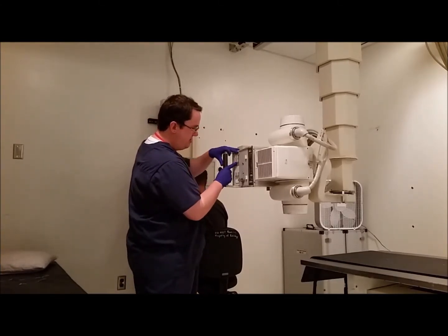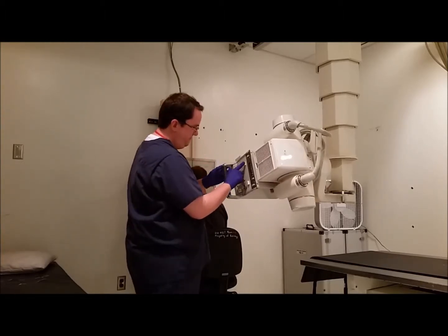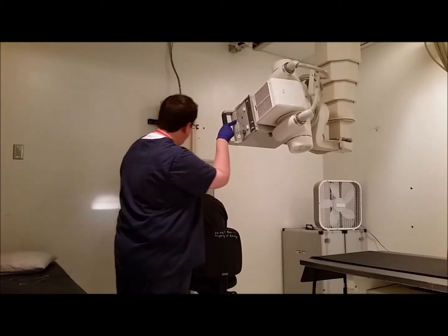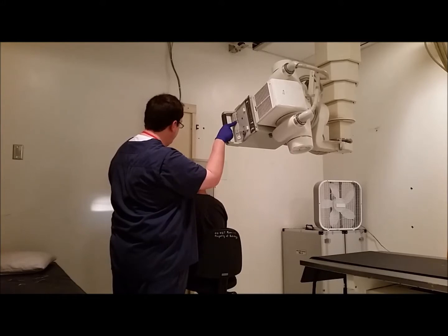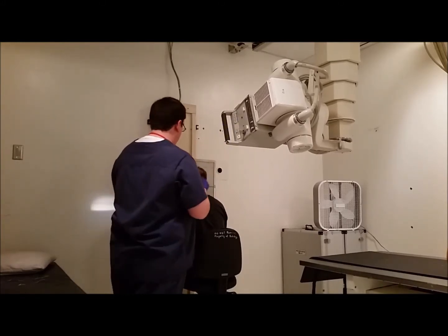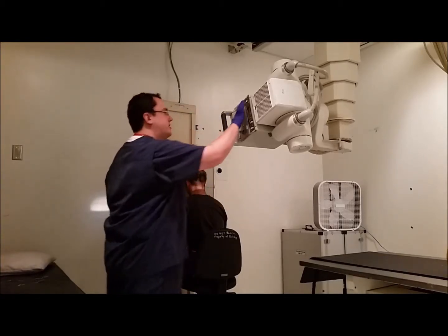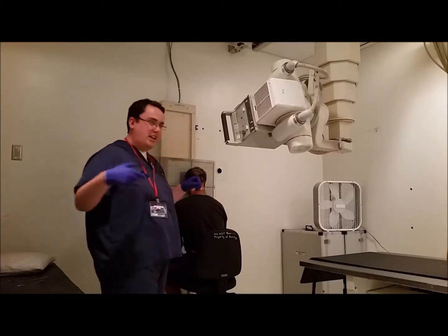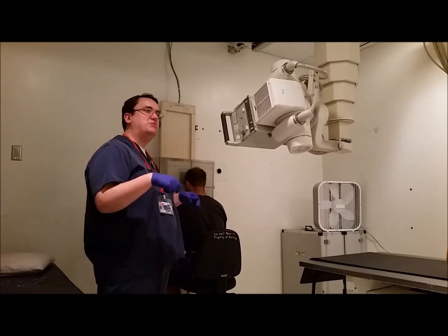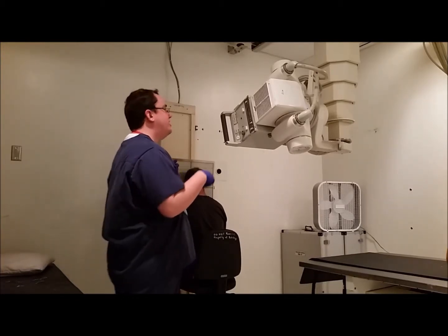15-degree caudal angle here. Have that directed to come out their nasion. Right about there. This is a Caldwell view. Get our marker on here. Right side. Alrighty. Have you hold your breath. Click. Shoot that one a little bit higher than the rest, about 75 at 12. Since we're doing a PA view, there's more that we're going through. Alright.